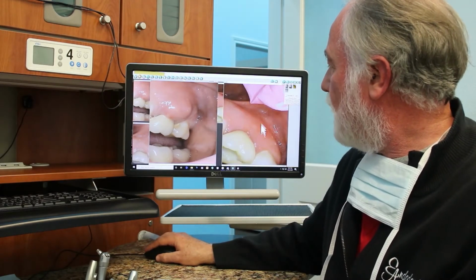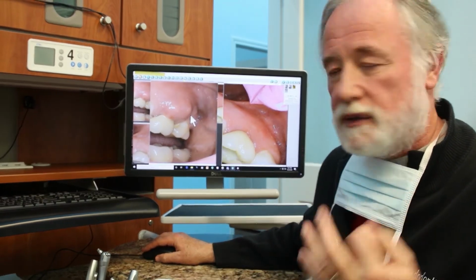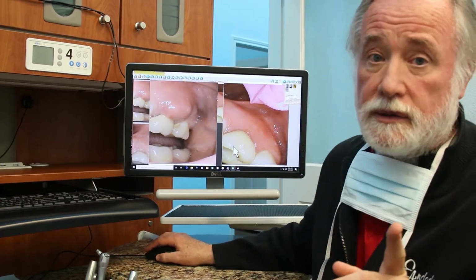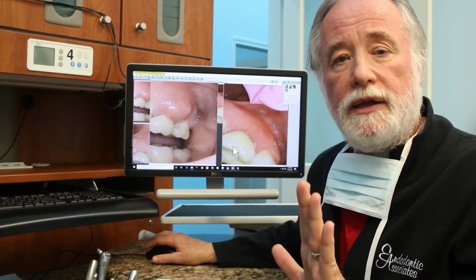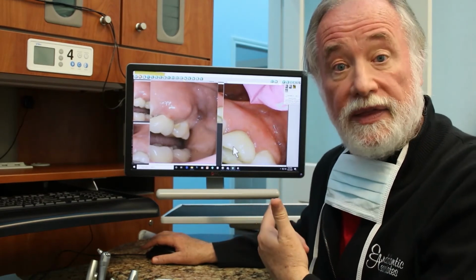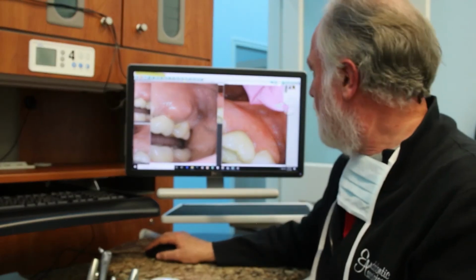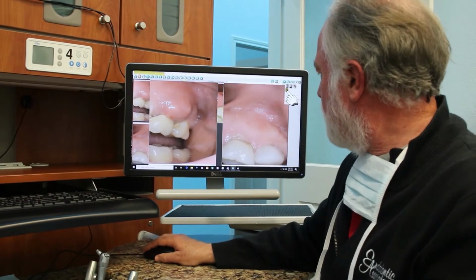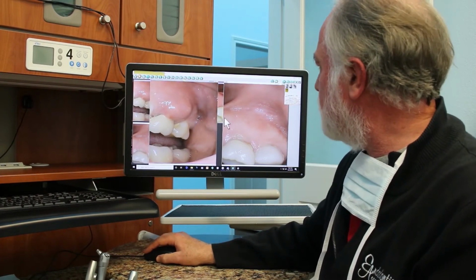Look at that. All of that area of swelling, all gone. 3 weeks. And no antibiotics in this one. This was just strictly from cleaning it out, getting the GentleWave to clean the tooth to a whole new level of clean, and this sinus tract resolved. Phenomenal.